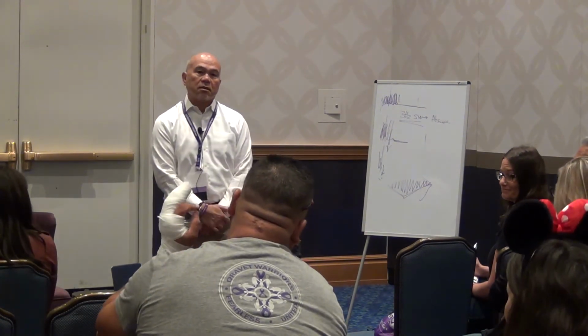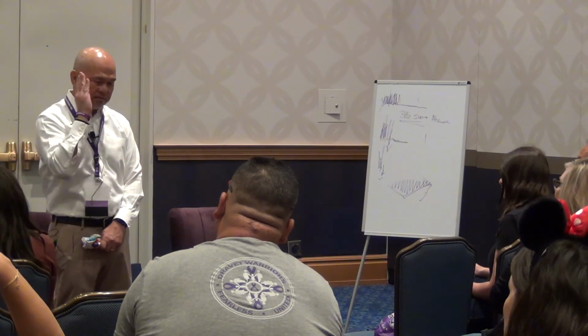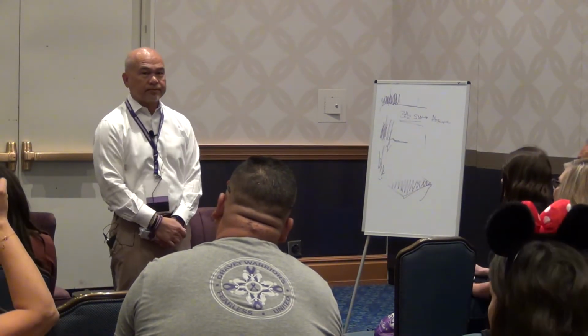So like the EEG will catch it exactly on the side of the brain it's happening? Yes. If you have been running the EEG and it's recording well, and you have a seizure during the EEG, I should be able to tell you if it's partial or generalized.